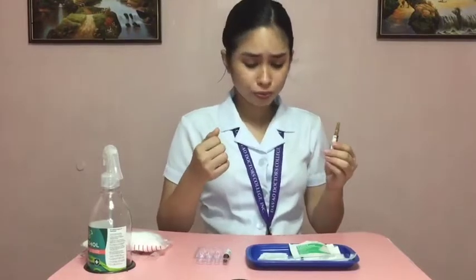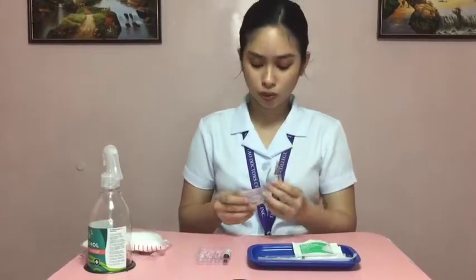I don't have any ampule opener, so we can use the sterile gauze to open this ampule. Before that, let's first wipe with an antiseptic wipe or alcohol pad the top and the neck of the ampule.